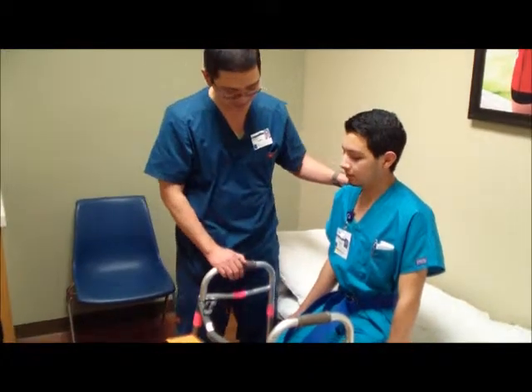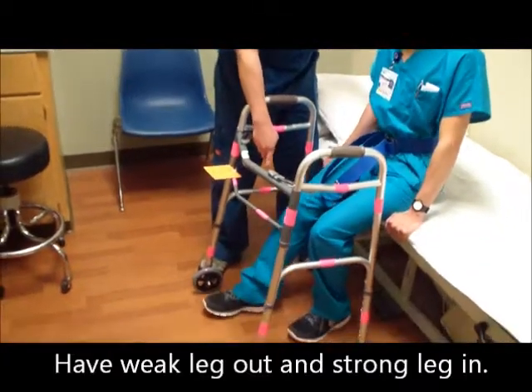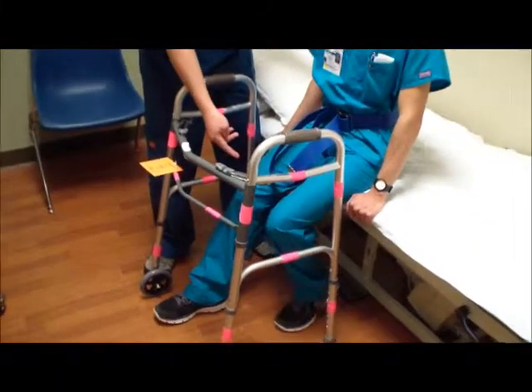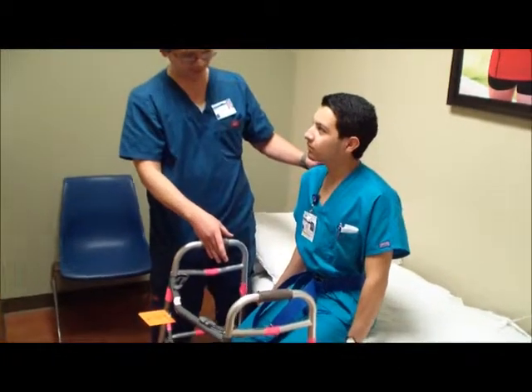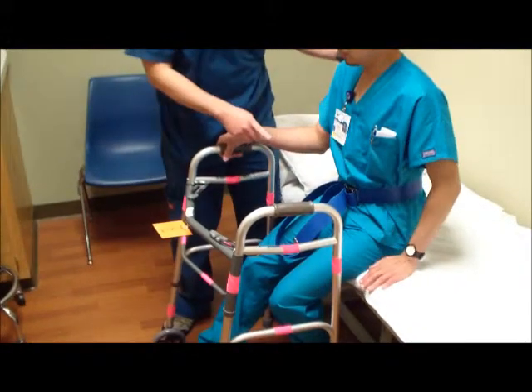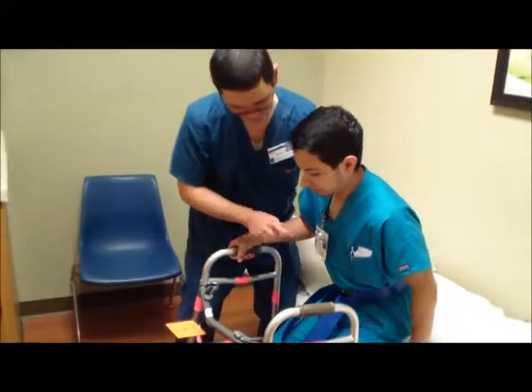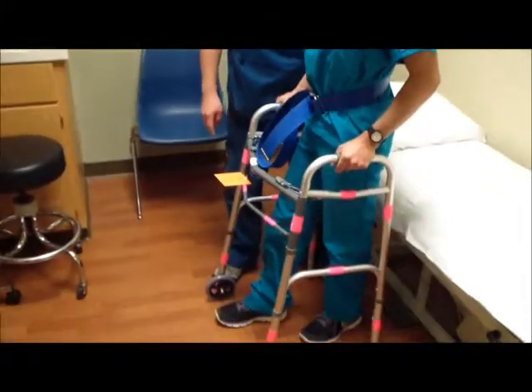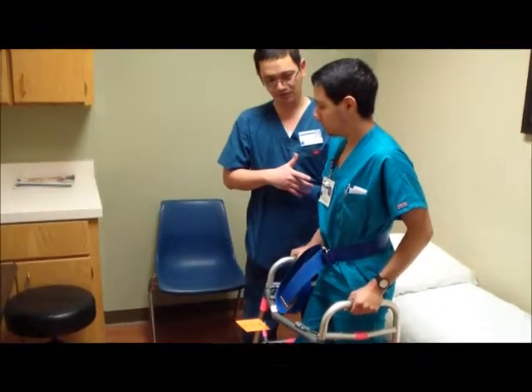Okay, so the way you want to do it is you want to instruct the patient to keep the right foot ahead of the left foot, and then bring your left foot towards the back. That way when he stands up, all of his weight will be carried by that good leg. Same thing, you want to have one hand on the walker and one hand on the bed. As we stand up, you want to put your nose over your toes. There you go.